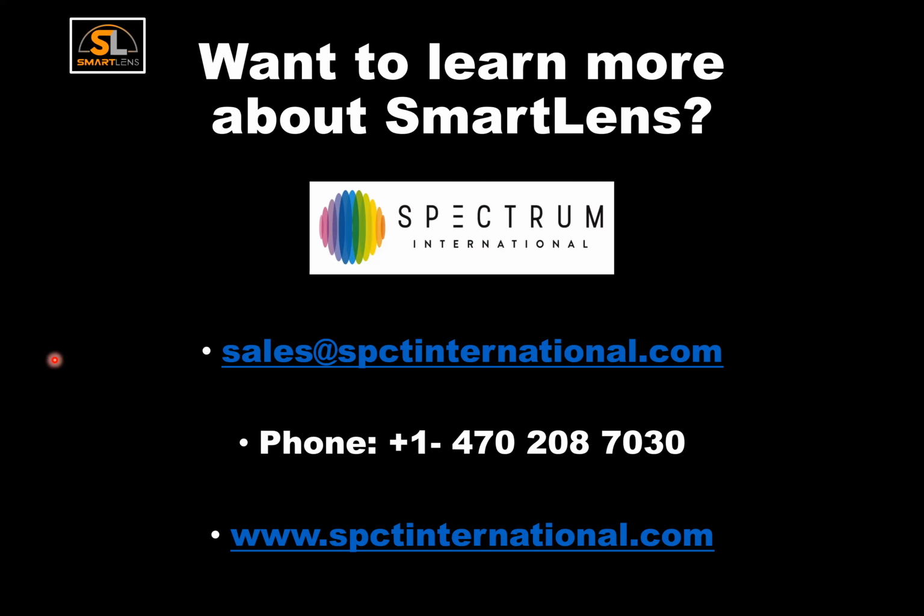So the reason why an increased edge lift is a minus adjustment in zone 4 is because in any contact lens in the world, this is any lens, not specific to SmartLens, if you increase the edge lift only of the lens, you decrease sagittal depth. That's a universal outcome of any modification to a contact lens edge. So that's why the SmartLens uses a negative adjustment for increased edge lift, because you are decreasing sagittal depth.